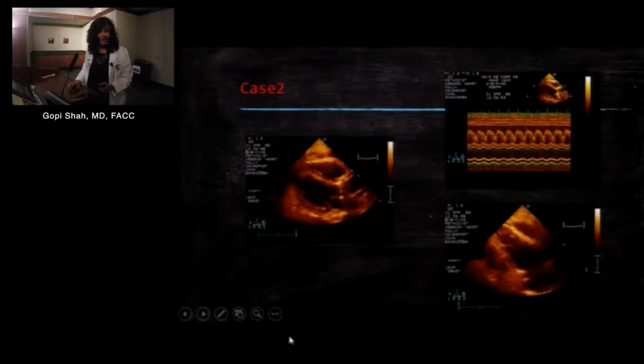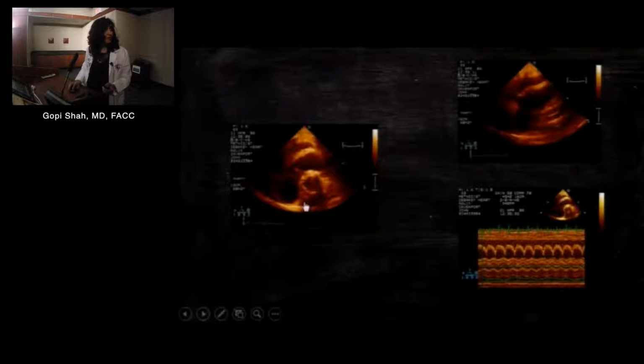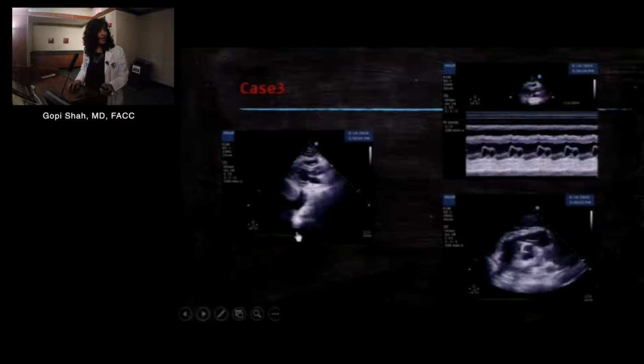Again, the right outflow tract being the most vulnerable area is also an area that you want to look at, even if the RV looks like it is expanding well, to see if there is any hemodynamic significance. Again, the M mode here and here. So multiple views show how nicely the RV has diastolic collapse, and this is, of course, tamponade with good clinical correlation required.